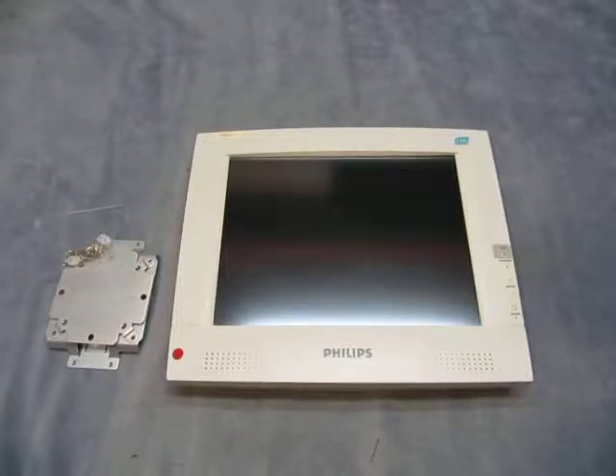For sale we have a Philips M1097A monitor. These are being sold as untested due to the fact I don't have a power supply. I was told they came from a working hospital, but I can't show you that.